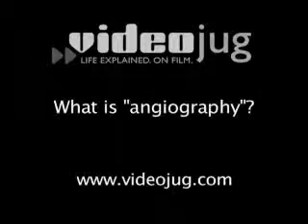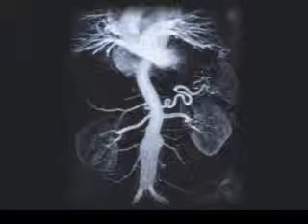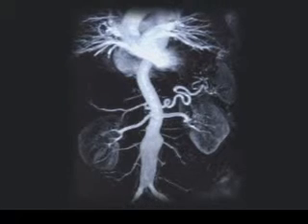Angiography. What is angiography? Angiography is the imaging of blood vessels. This can be done in a number of ways. In the past, the only way we had for imaging the blood vessels in a radiology procedure was by placing a thin plastic tube into a blood vessel, injecting some iodine-containing dye, and taking X-ray pictures.